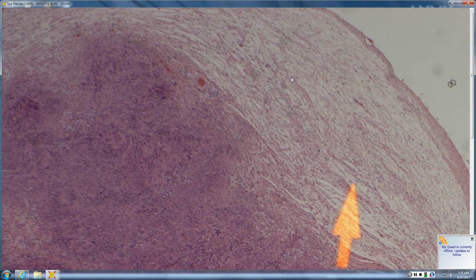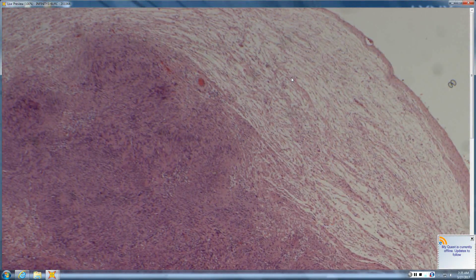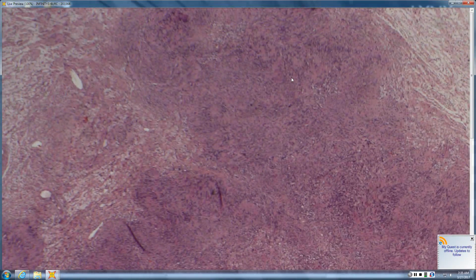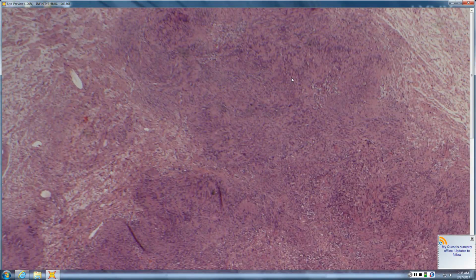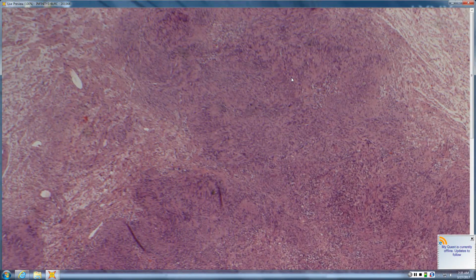They tend to have a crescent-shaped zone of subcapsular edema, which is the Antoni B. Centrally is where you tend to find the Antoni A, the denser, non-edematous tissue, which often has the palisades of Schwann cells. Whereas neurofibromas have all elements that support the nerve, Schwannomas are Schwann cell only.